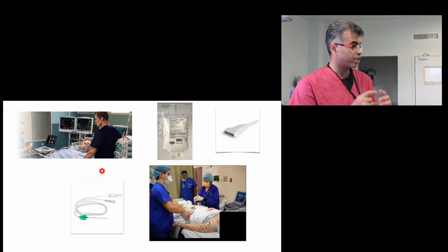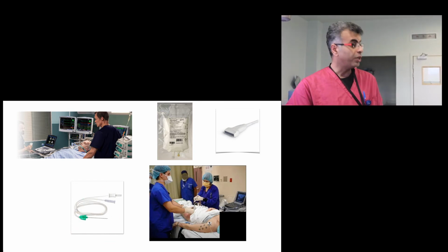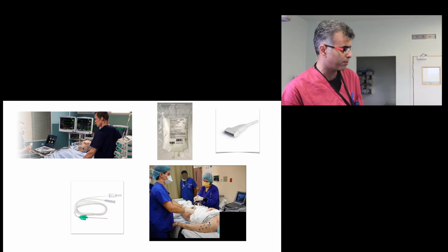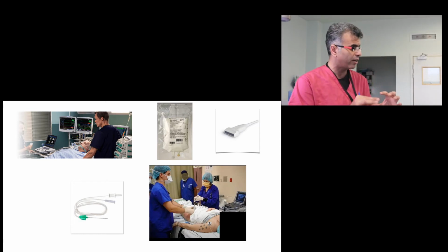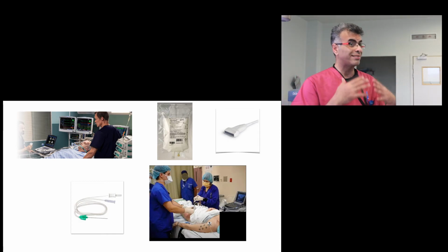Adjusting your settings in the ultrasound machine, adjust the depth to no more than 3 to 4 centimeters. Your needle is about 50 millimeters, 50 to 80 millimeters. That's enough for doing this block because you can't easily manipulate it around the nerve. One of the things that is also very important is your ergonomics.